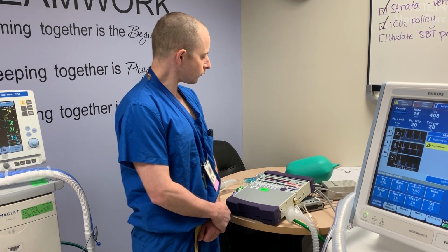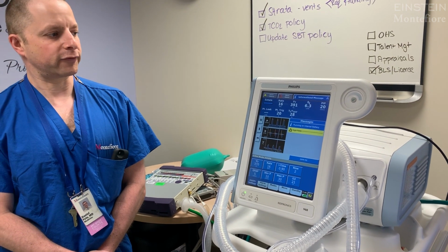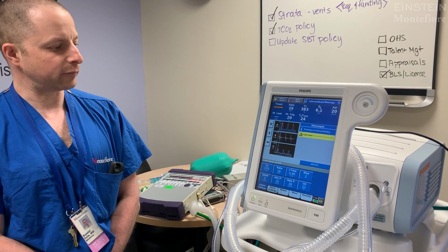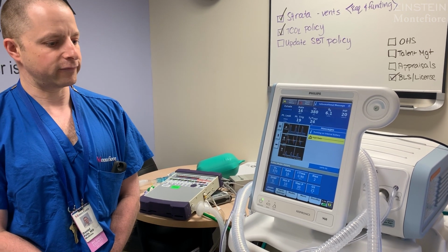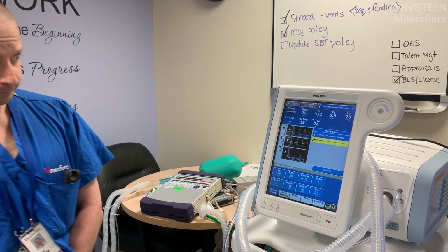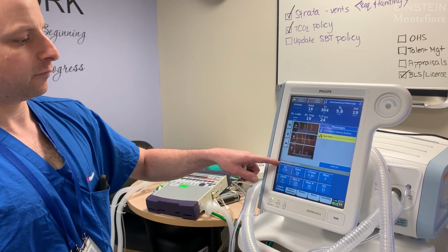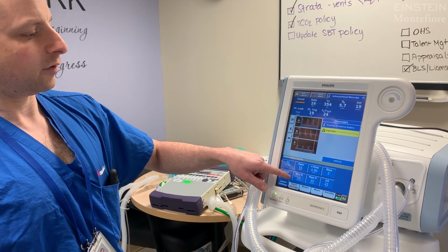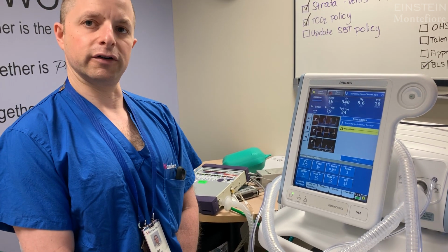And then the third type of ventilator we're commonly using is called the Philips Respironics V60. Prior to the COVID-19 pandemic, this ventilator was most frequently used for non-invasive ventilation, but now we've employed it for patients who have either tracheostomies or ET tubes in place in what's called the AVAPS mode, and we're finding that it's quite effective. What you do in AVAPS mode is you set a tidal volume, and then you tell the ventilator it could deliver between a minimum and a maximum pressure, and it finds what pressure it has to give in order to deliver that tidal volume.